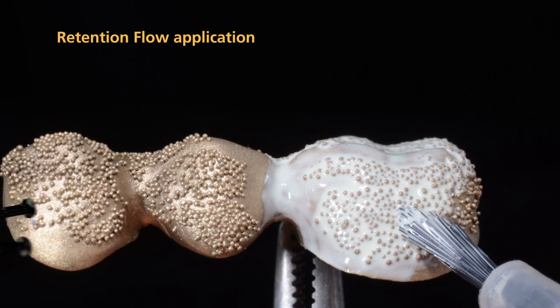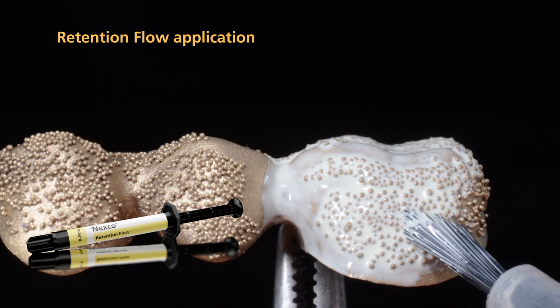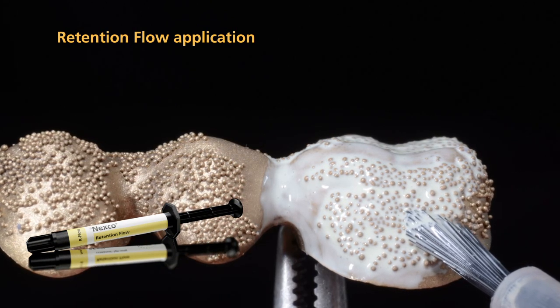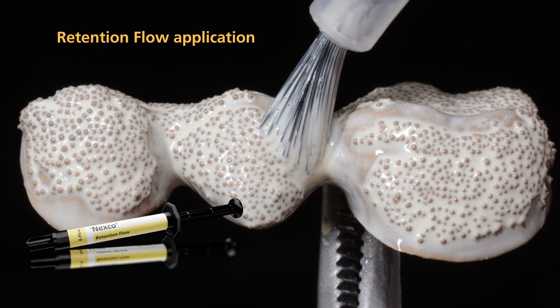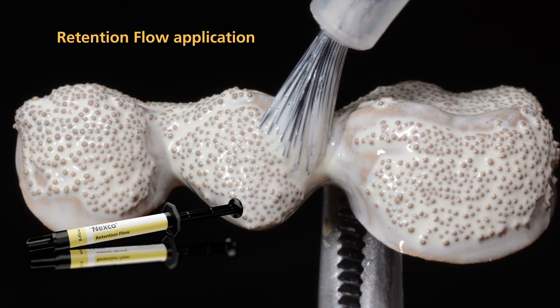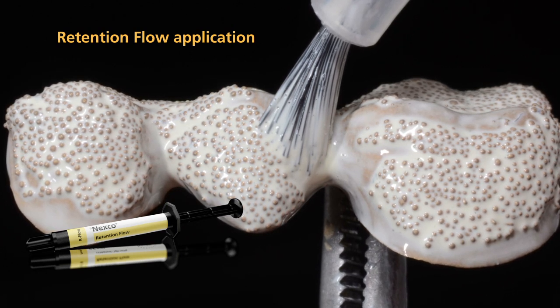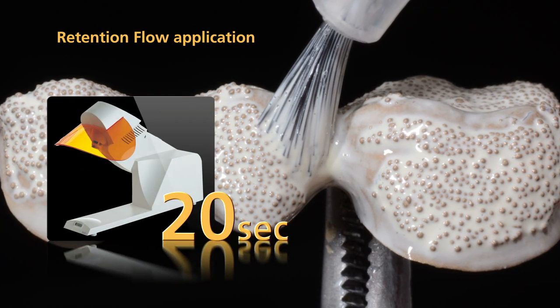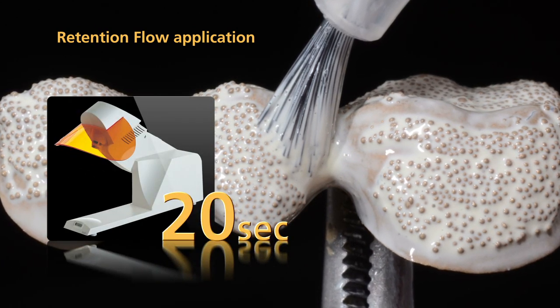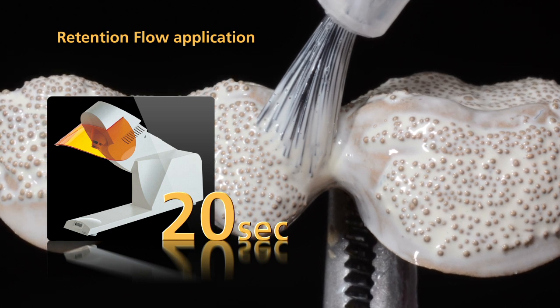The application of SR-NEXCO retention flow is optional. This material easily flows into the spaces under the retention beads due to its low viscosity, which increases the effectiveness of the bond. Apply retention flow to the undercuts of the retention beads with a brush before you apply the first layer of Opaquer. After that, light cure retention flow for 20 seconds with a quick pre-curing light.